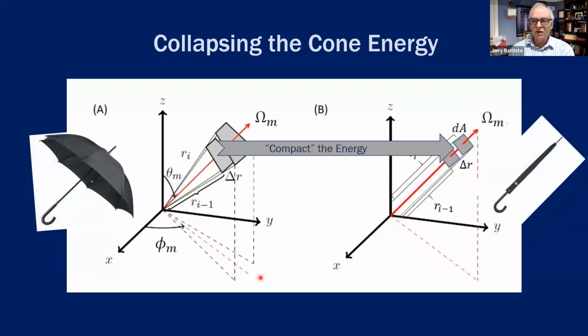It's very efficient. If you're having trouble with this concept, think of this as an umbrella, and you take all the energy from the outside and you fold it in along the axis here. And then you only have to worry about energy propagation along that direction.